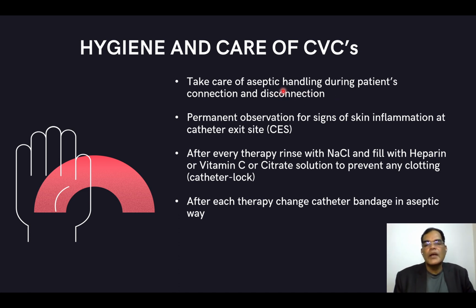So there can be contamination during connection and disconnection. We need to be very careful during these two procedures. And also we need to check for skin inflammation at the exit site. This has to be done on every dialysis.